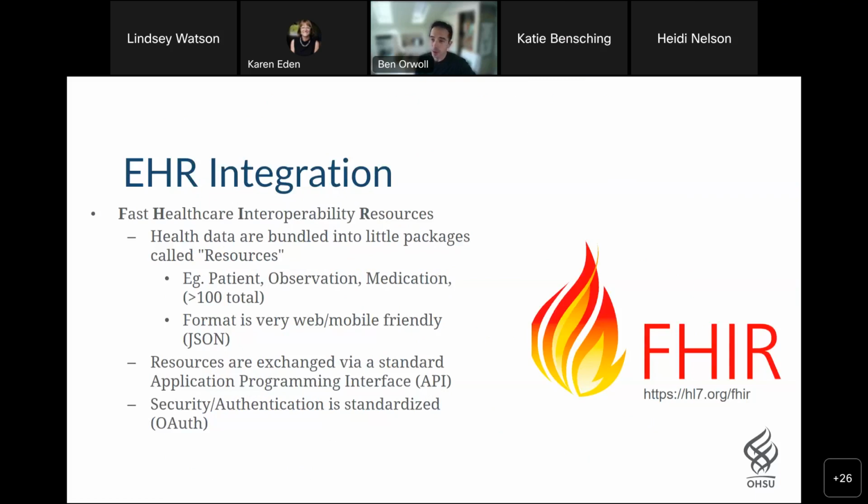I'm going to talk a little bit about our EHR integration and some of the things that we've done and some of the things that we've learned. So to support all these assessments and clinical workflows that you've heard about so far, we had to do a lot of work to integrate MammoScreen with the EHR that we all know and love so well.